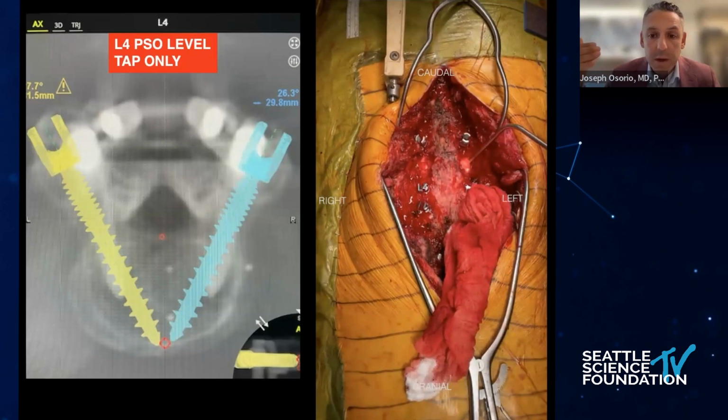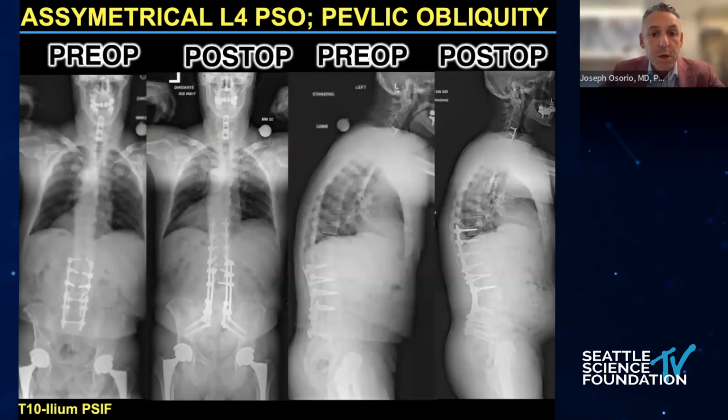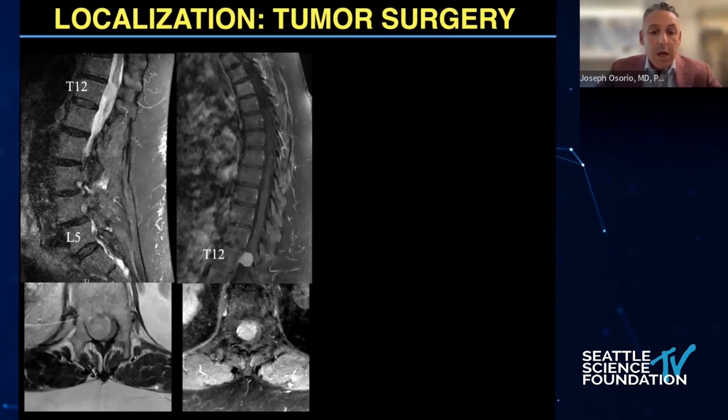And then when I'm working with my co-surgeon, we're operating at the same exact portion of that L4 level. I'm suctioning for him if it's needed, if they're having some issues on the opposite side, or vice versa. So it's actually a very helpful tool and technique. And by the time you get to the PSO, because the hemostatic agent has been in there, it actually behaves a lot better from a blood loss perspective. That's the results from this case.